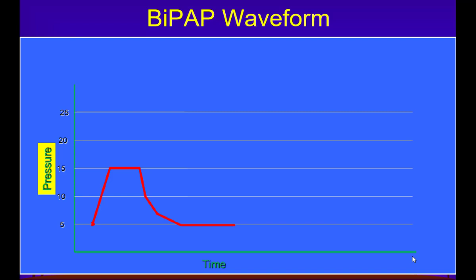So let's talk about this and understand it by way of this waveform that we have. This is the EPAP, this is the baseline pressure, this is the EPAP, and you can see this is the inspiratory.